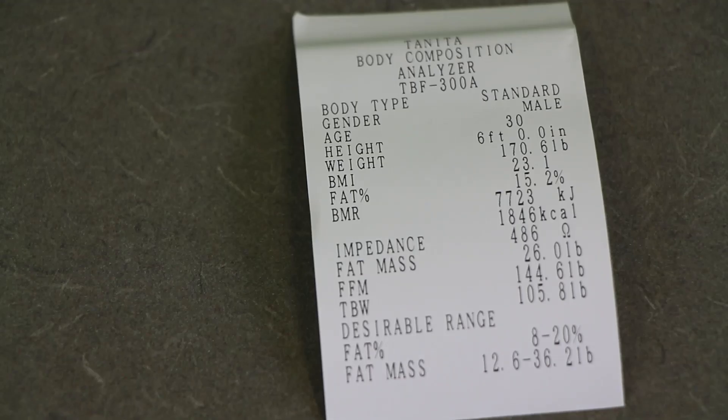Here's an example of what the printouts look like. You can see the body type listed across the top, along with the sex of the individual, their age, weight and height, and their BMI — body mass index. Then you see fat percentage, which is the real reason we use this technique, so we can see how much body fat somebody has. You also see the BMR — basal metabolic rate — which is the estimate of what that person needs to consume in calories or kilojoules to maintain their body weight at their current weight.